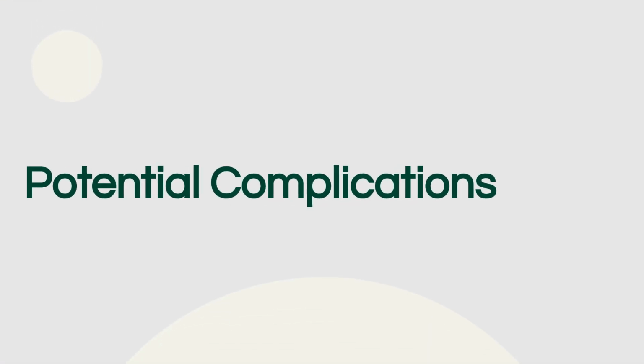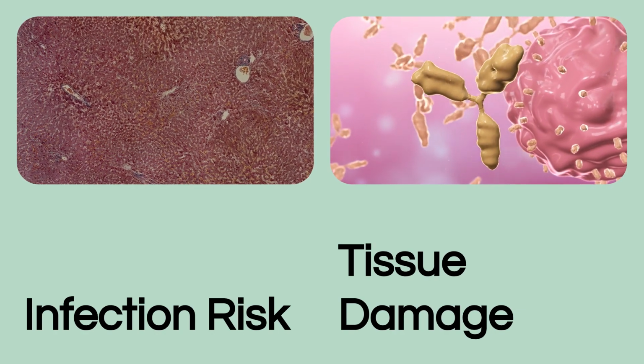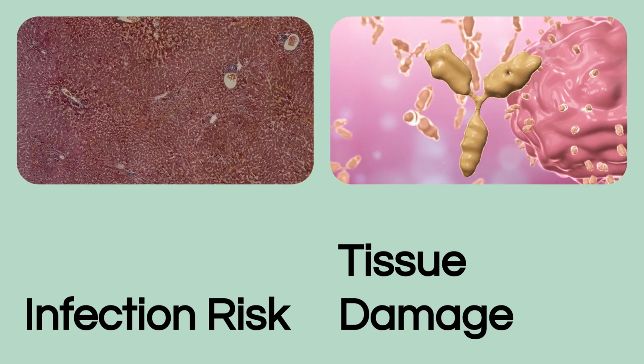While necessary, drains are foreign bodies and carry inherent risks that must be managed. The primary risks are infection, either from bacterial invasion or a foreign body reaction, and tissue damage caused by high suction or erosion into nearby organs.